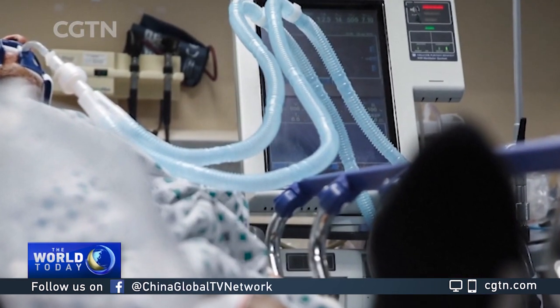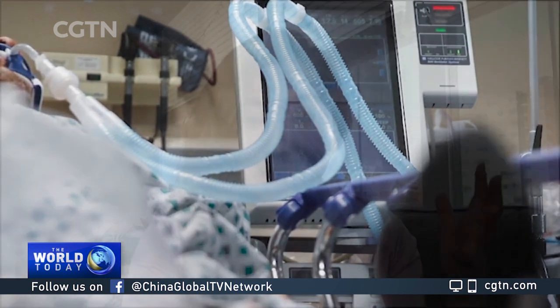There's also a controller to monitor and adjust airflow. How well they can move air in and out of their lungs, as well as how much air they need, is going to be different between each patient. So we hope to address this by allowing the clinician to actually change the amount of air that each patient is getting afterwards.